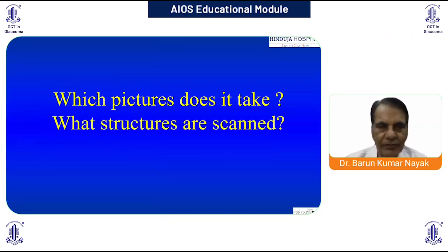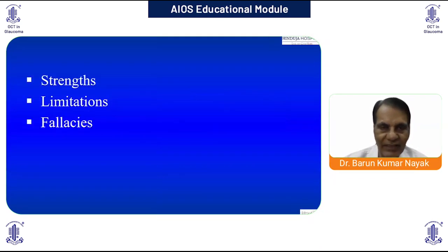Firstly, which pictures does it take? What structures are scanned? We have to understand the basis of these scans, and how to interpret them. Along with that, we have to understand the strengths, limitations, and fallacies of those recordings.